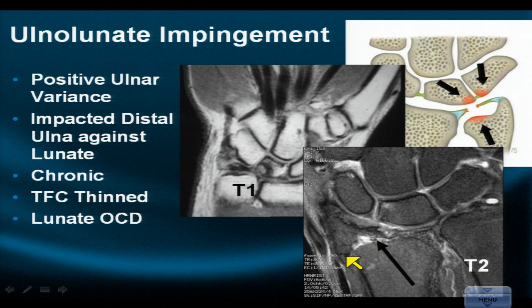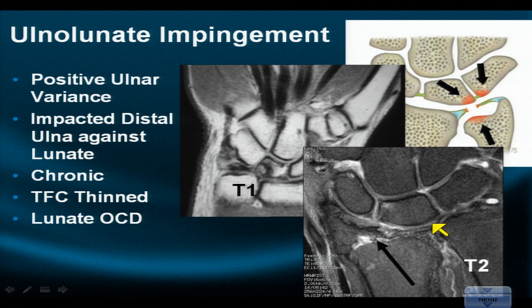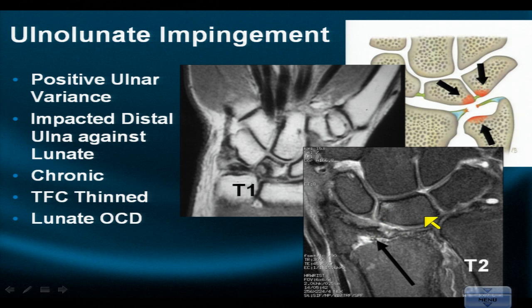Sometimes this alteration in variance can occur as a result of trauma. In this individual who has fractured the radial styloid with marked arthrosis on the radial side, the ulna is now protruding distal to the non-styloidal radius, causing ulnar side pain. It has destroyed the central third of the triangular fibrocartilage — it's perforated. There is triquetral chondromalacia, loss of the lunatotriquetral ligament, loss of lunate hyaline cartilage, and deformity of the proximal lunate. The patient's symptoms are on the ulnar side, not the inflamed radial articulations.